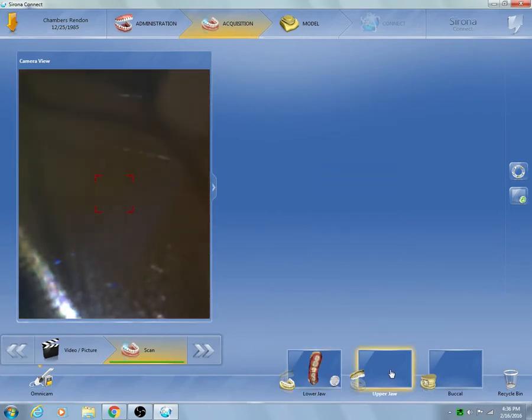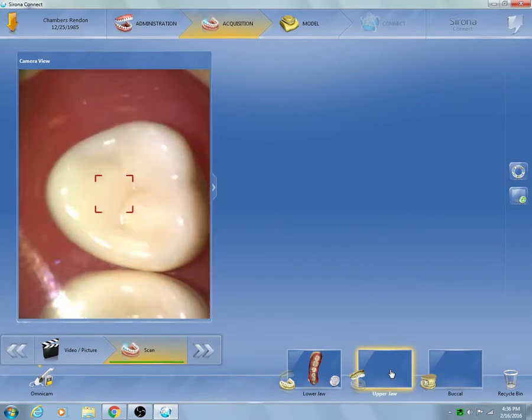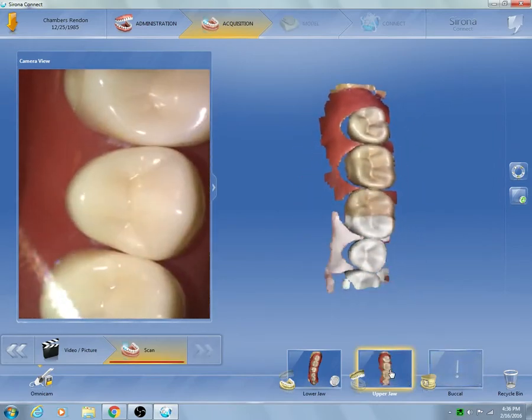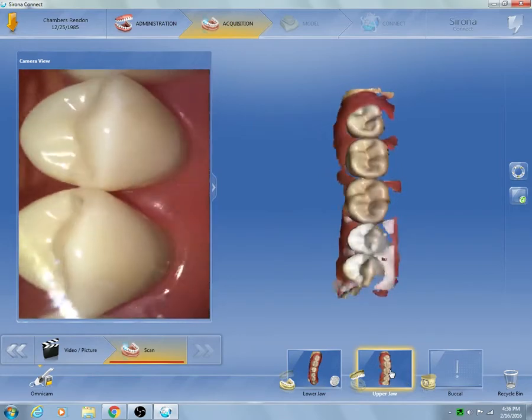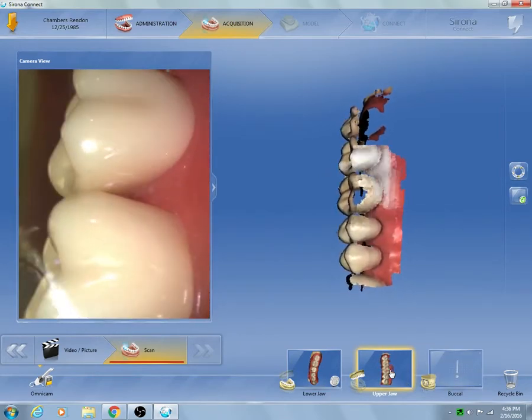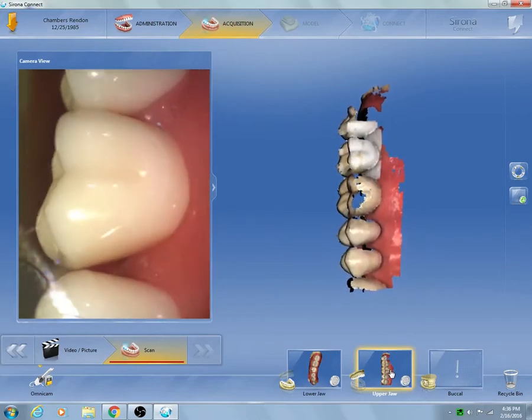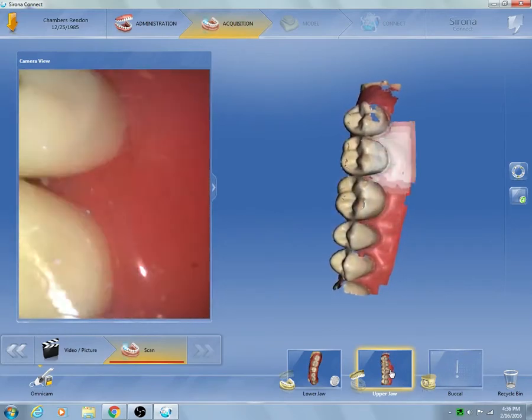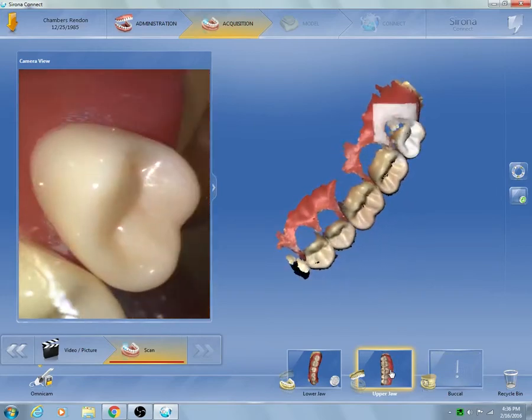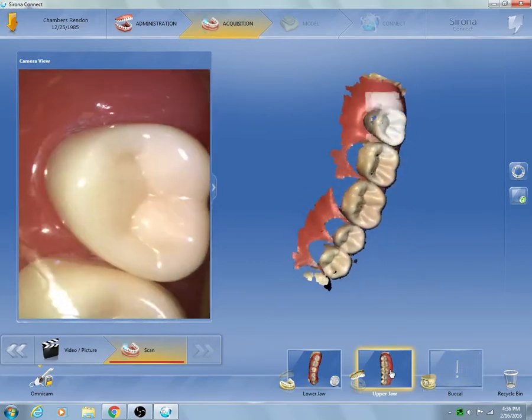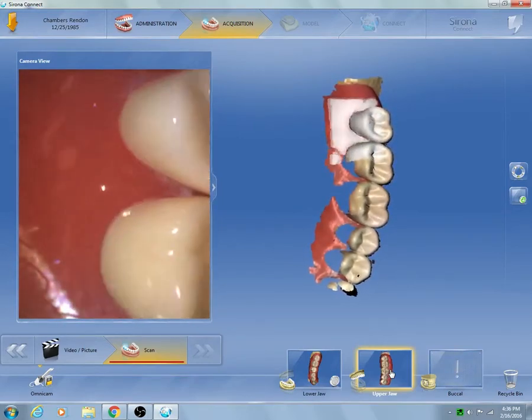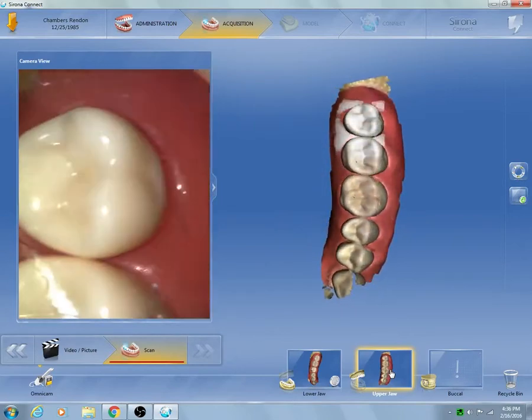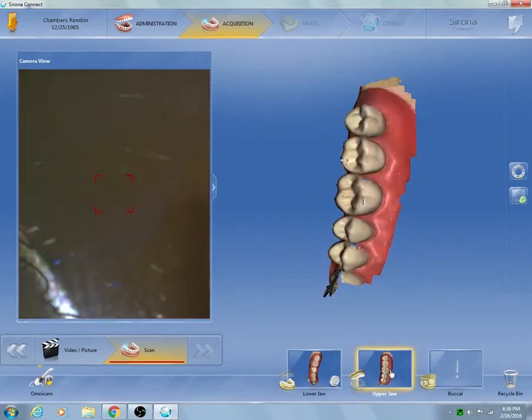At this point I'm going to move on to my upper jaw. We'll enter the patient's mouth, start occlusally, and pull mesially along that occlusal surface nice and slow to acquire the needed information, at which point we'll rotate to the buccal facial aspect. We'll push back distally, and as we go I catch any missed blue areas. I rotate over to the occlusion, back to the lingual aspect, and pull back towards the mesial to acquire all the lingual information needed for a good restoration.